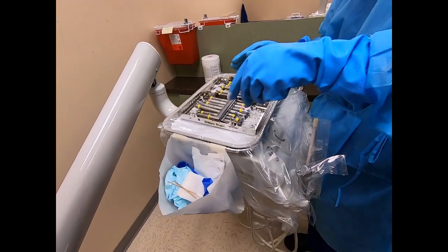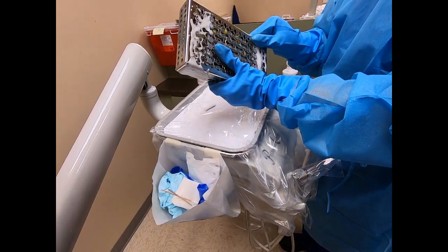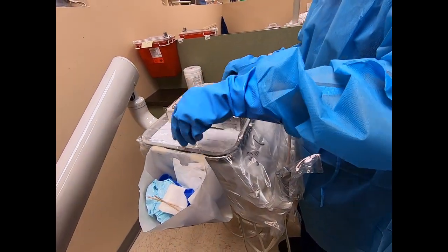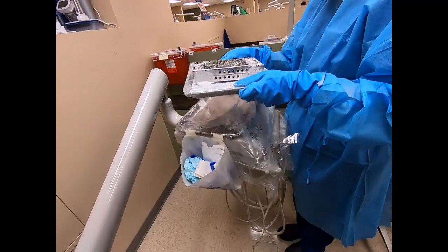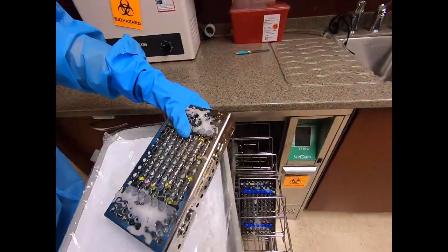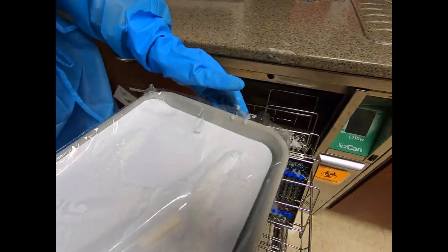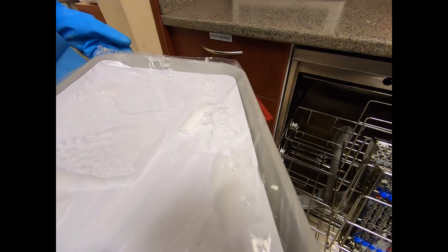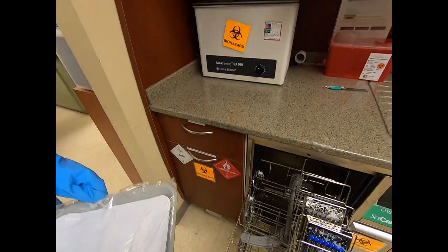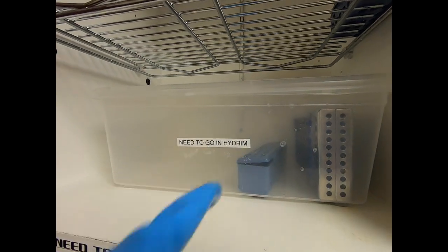Ensure that the instruments are positioned correctly and the cassette is closed and locked before transporting the tray to the sterilization area. When you transport your cassette into the sterilization room, you will load it immediately into the Hydrim, and if it is unavailable to load, you will place it in the cabinet in the container labeled "Needs to go into Hydrim."